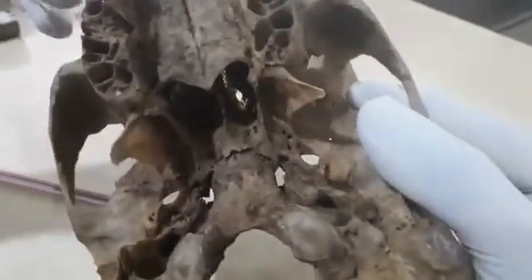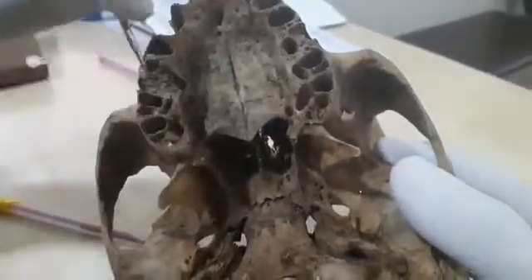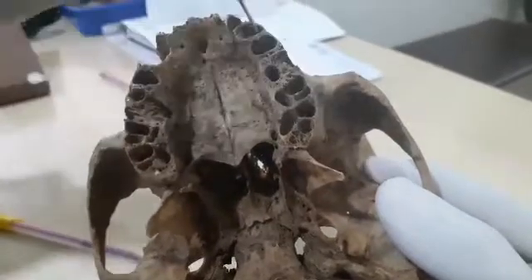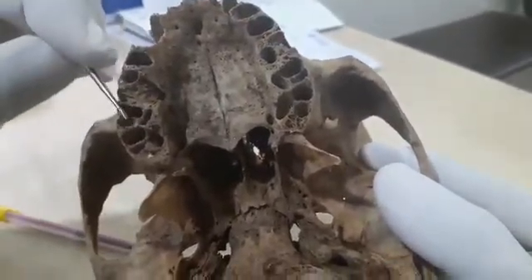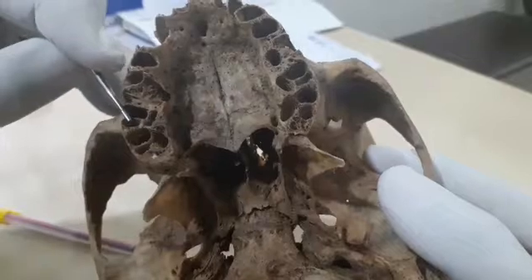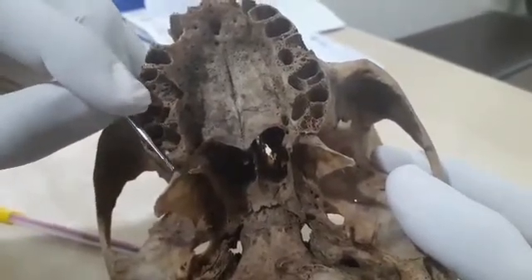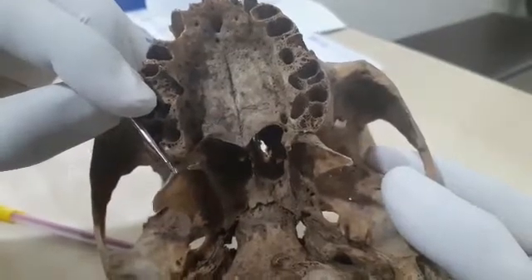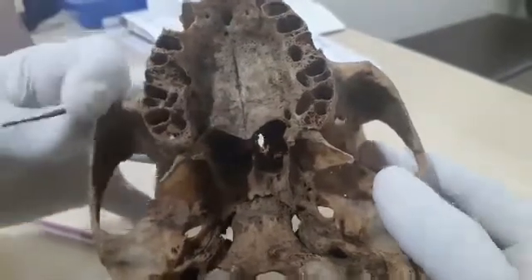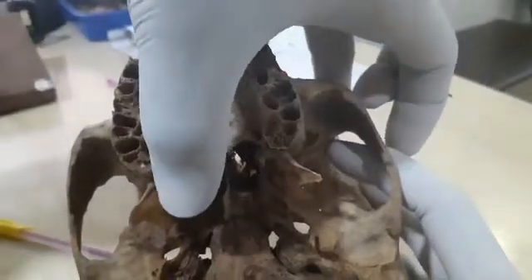So your angulation should be like this. See, if this is the ridge, then you should go slightly buccally and towards the medial side, and insert your drill like this.